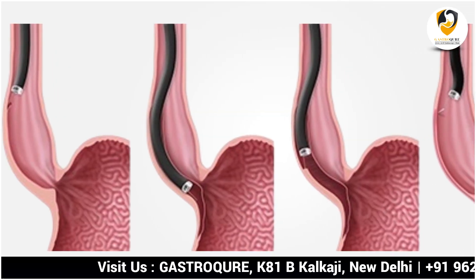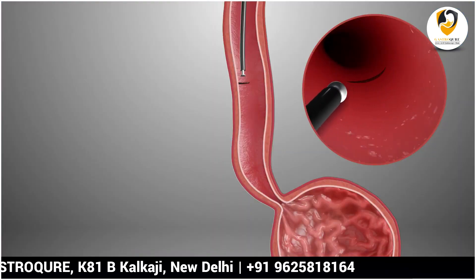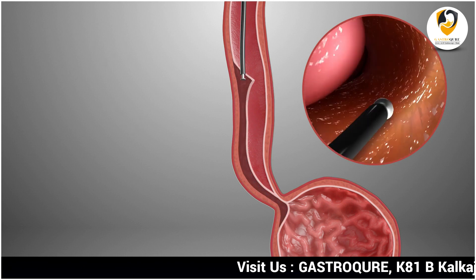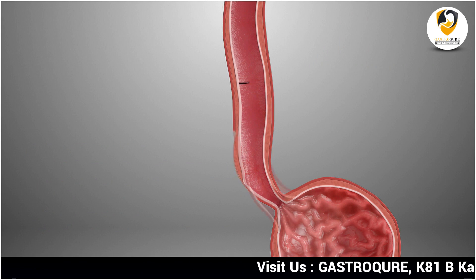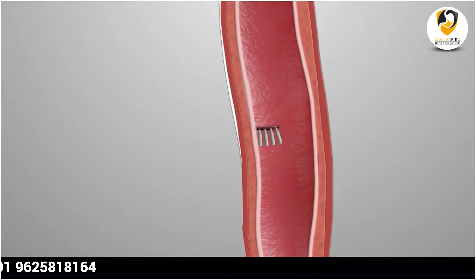POEM is the solution for all these problems — to ease the passage of food across the valve of the esophagus into the stomach. In the POEM procedure, the tight valve of the esophagus is cut open by endoscopy itself; it doesn't require surgery. The endoscope is placed inside the food pipe, a small nick is made, and the endoscope is placed into the submucosa. A tunnel is made and extended beyond the gastroesophageal junction by two centimeters. Then the valve of the esophagus is opened and cut, and subsequently the nick is closed with multiple clips.